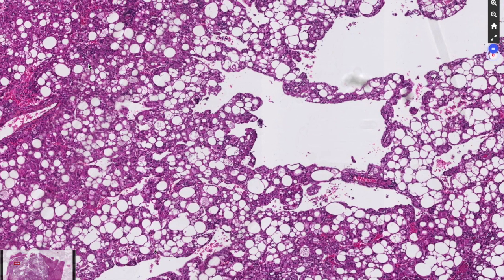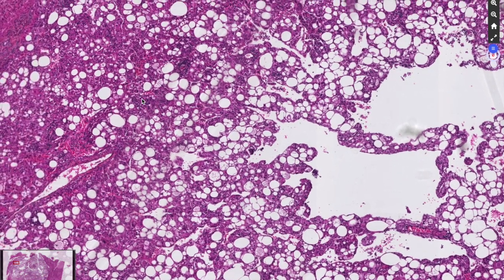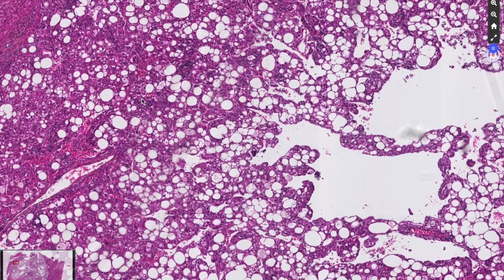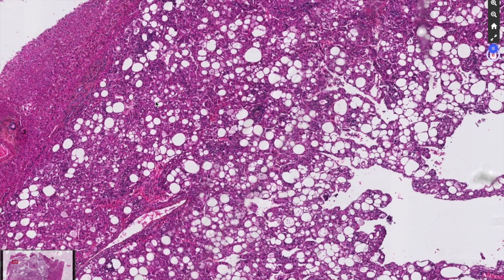So you can confirm the diagnosis here with HMB45 and Melan A, which will stain positive, and you can also rule out melanoma by doing S100. The clinical behavior of epithelioid angiomyolipoma is unpredictable.